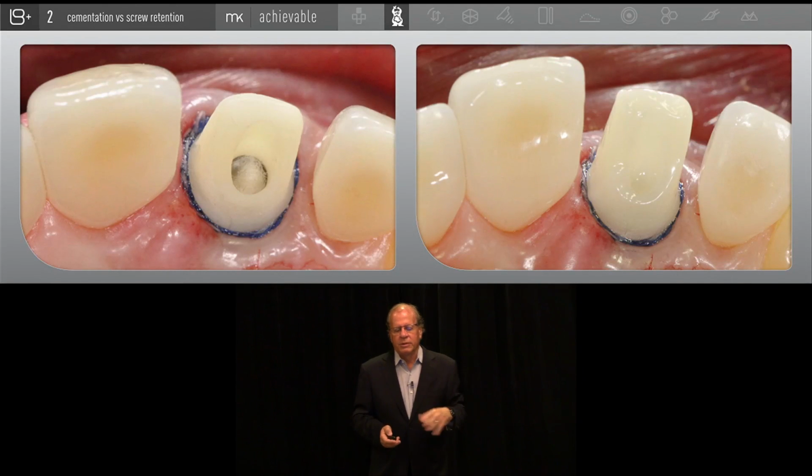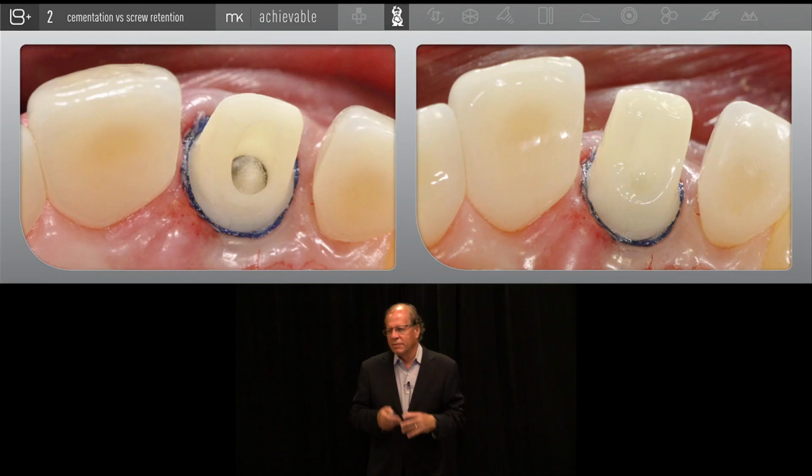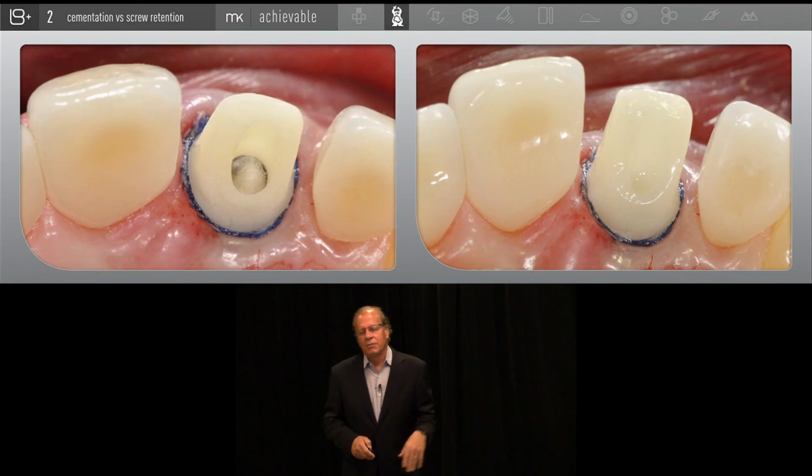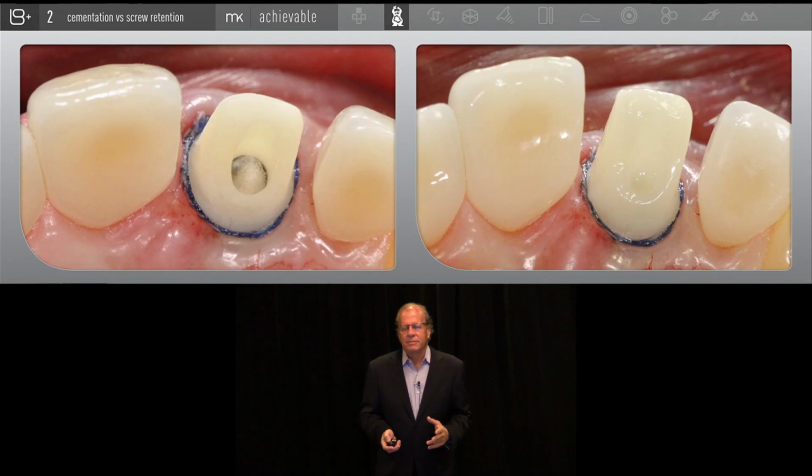So what we do is we leave the abutment open. We just cover the head of the screw. We leave the entire chimney open to act as an internal vent. So as we cement, we have a deflective cord to inhibit the cement from going deeply into the sulcus, and we have an internal vent, and the cement will go down, hopefully, into that vent and minimize any cement trapping. So that, I hope, is inspirational to you.